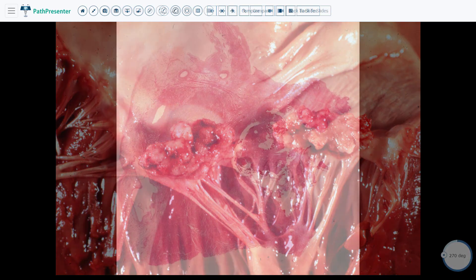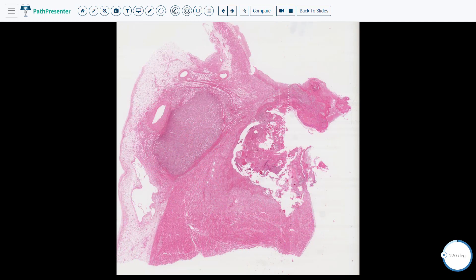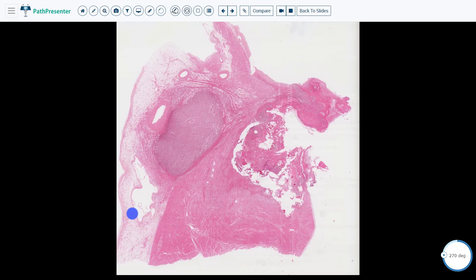Let's go on to the histologic section of this case. This is the section of the mitral valve. This area up here is the left atrium, and down here is the left ventricle — I can tell because it is quite thick. The layers are endocardium, myocardium, and epicardium. The mitral valve leaflet is right here. You can see there is a very large vegetation. There is also destruction of myocardium and an epicardial abscess.